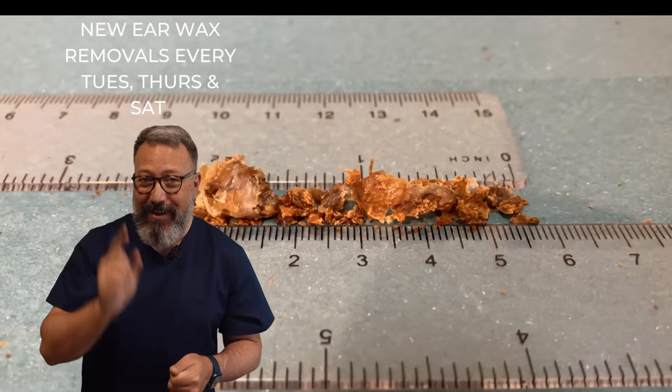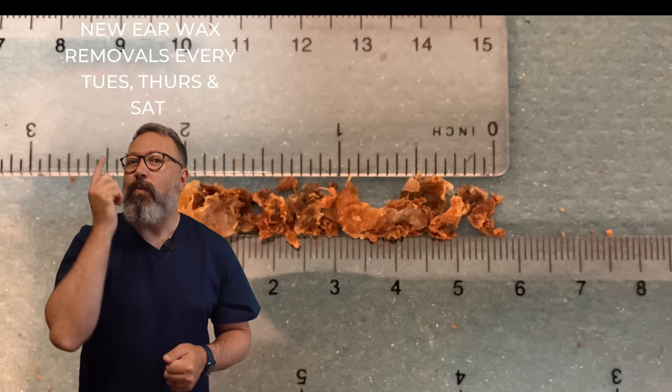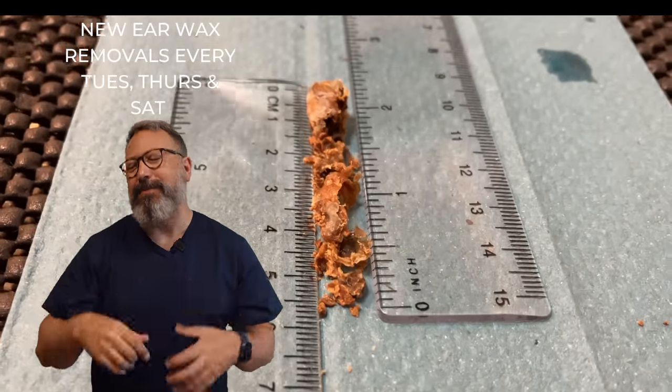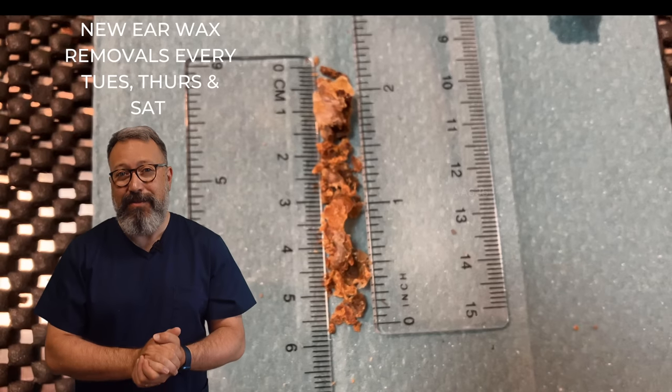This is what we took away — five and a half centimeters, two and a quarter inches, from one ear canal. And they're not small pieces. You put it end to end — these are big pieces and they are huge. You can see that's a really good one to watch.